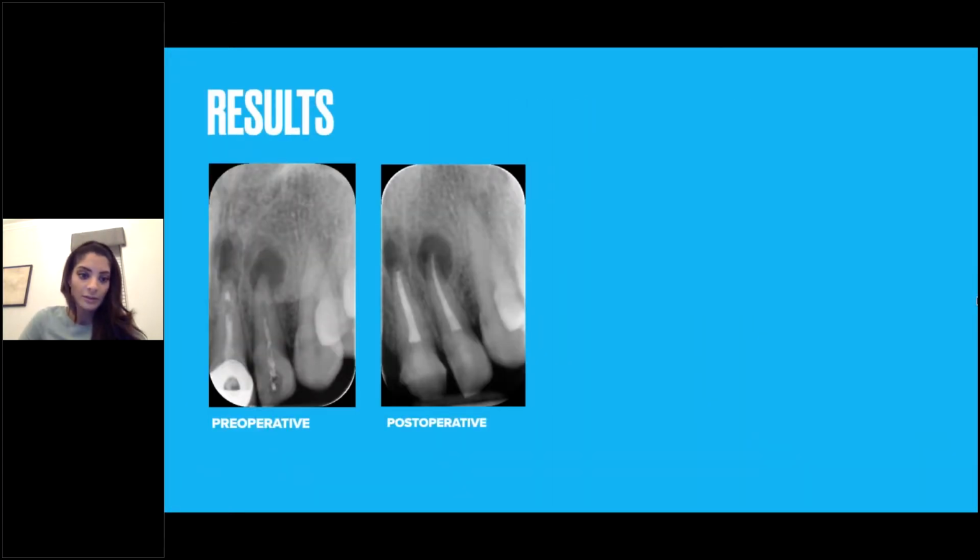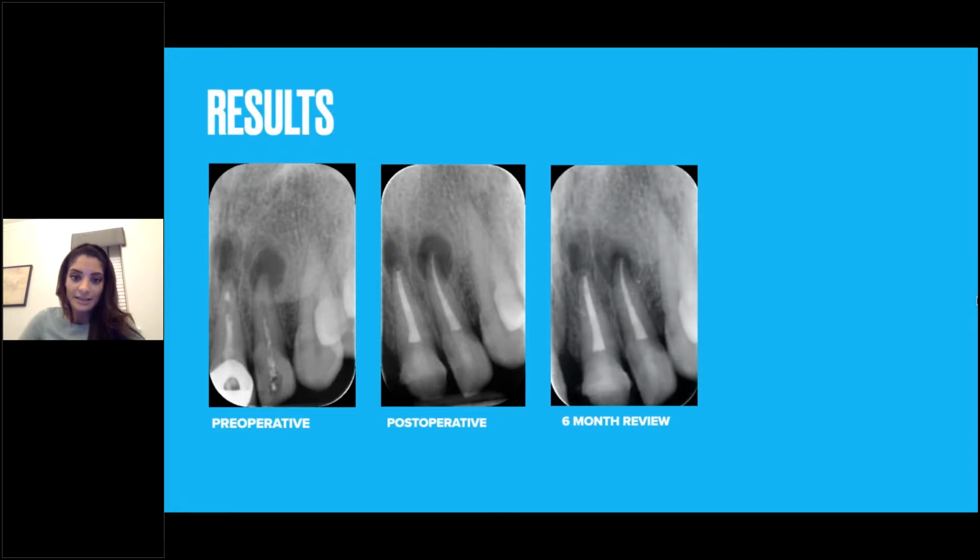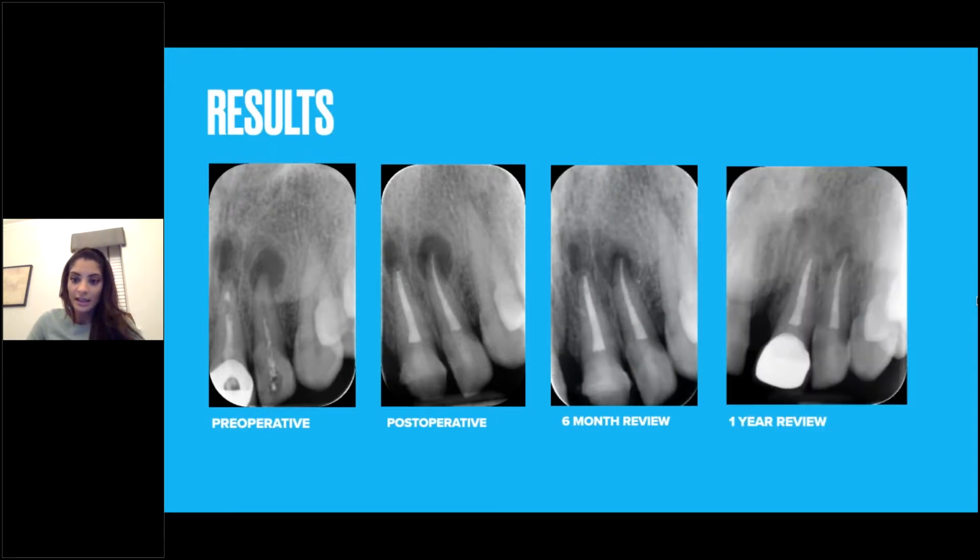So this was preoperatively, this was postoperatively. This is at the 6-month review, and we can see that the lesions are healing nicely. And this was at the 1-year review, and we can see again very good resolution of the lesions at this stage.